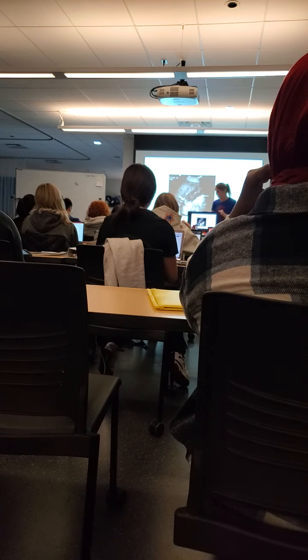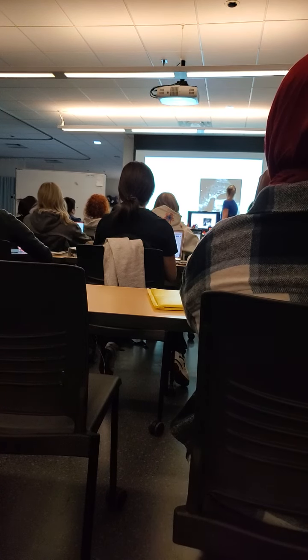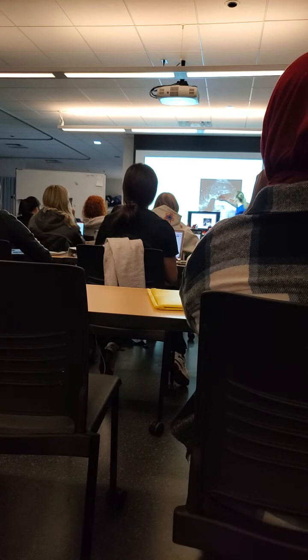Okay, so here is a chronic cholecystitis. Yucky, yucky. So here's another one. Here's our gallbladder, looking very contracted. Here's the lumen. What is going on with this guy? Stone. And then we've got this thickening wall. We've got that hyperemia versus edema in the wall.